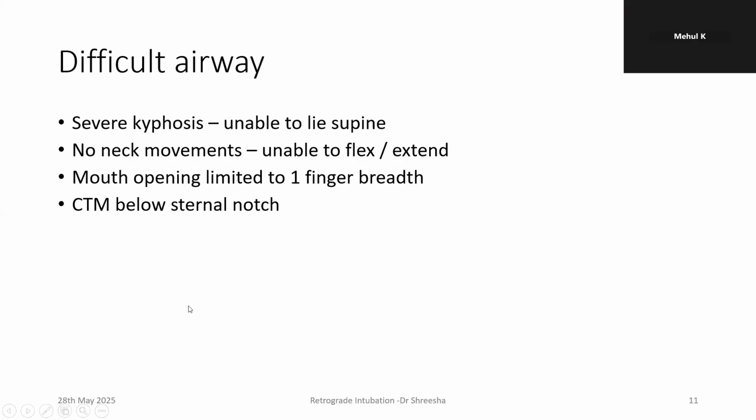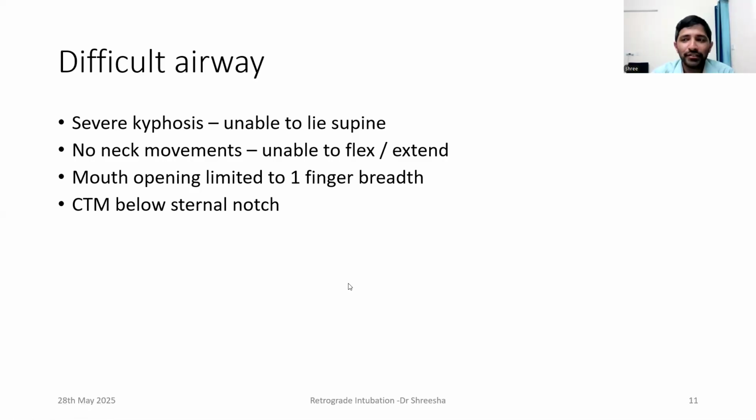Okay, Dr. Vishnu says surgical cric. Sorry, Dr. Vishnu typed out in the chat box surgical cric. He likes to type. So, surgical cric should ideally be done in this patient, but the problem here was the cricothyroid membrane was below the sternal notch, and since the patient was gasping during deep inspirations, the cricothyroid membrane was popping up above the sternal notch. So cricothyroidotomy was again not really easy in this patient.